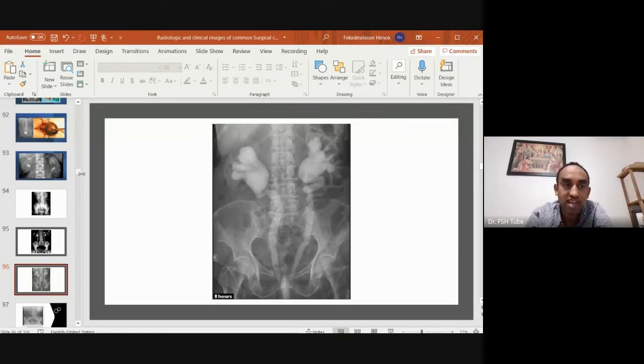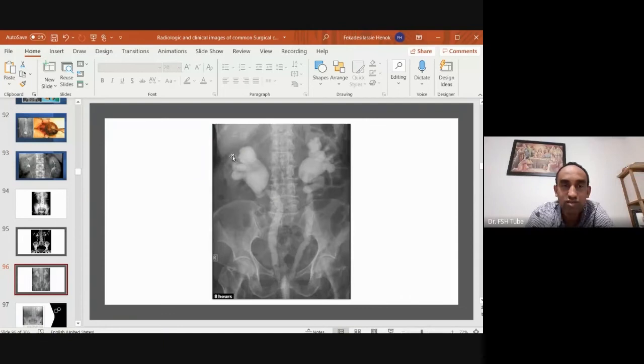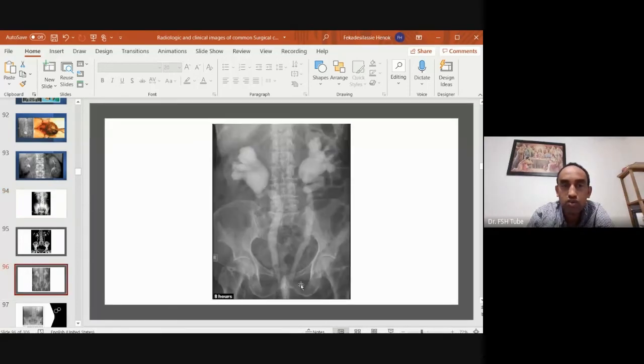So the pelvicalyceal system I showed you, right? These, you see them, they are not blunted, they are thin, somehow concave shaped. In the interior, they are concave. So when you come here, it's completely gone. That is blunted. The pelvis is so dilated. The pelvicalyceal system dilatation, blunting, clubbing, it's just blunted like this. They are no more concave, and it's bilateral. And you see the ureter, which is super dilated. So this is a normal ureter, you see? It's not dilated, but here, the ureter is so dilated bilaterally.